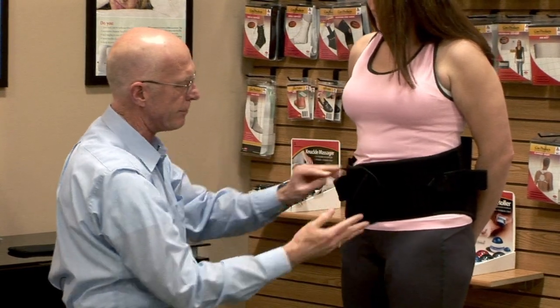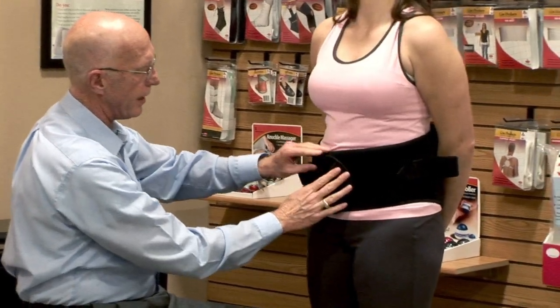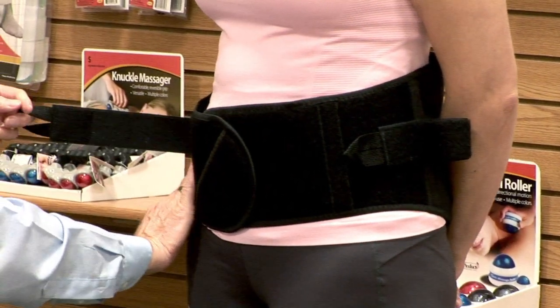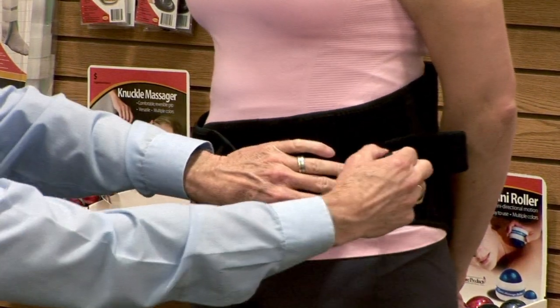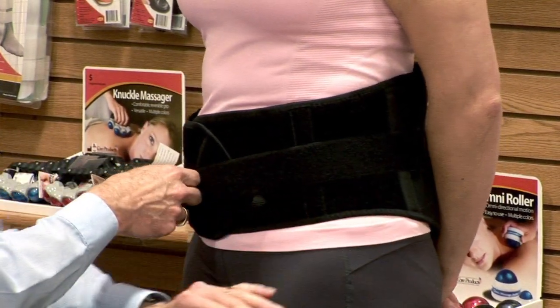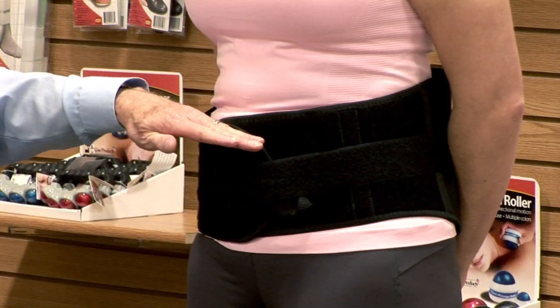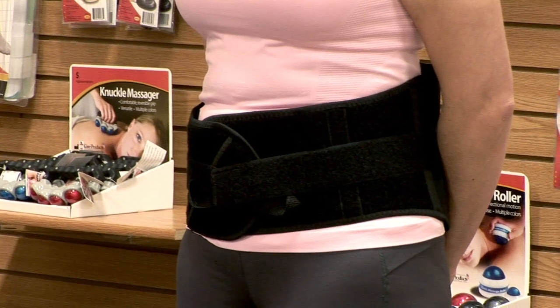Do the initial closure — reasonably snug is fine, it doesn't have to be tourniquet tight. Make sure the Velcro doesn't touch the patient's clothes and that there's a good overlap, and that the anterior panel is centered nicely. Now we can take the cinch straps, stabilize the hips, and apply pressure. They can cross over or lay on top of each other. The patient will generally feel more support if the cinch straps are relatively lower on the abdominal wall, as opposed to being higher up — this will help support that lower abdomen area and take pressure off the spine.